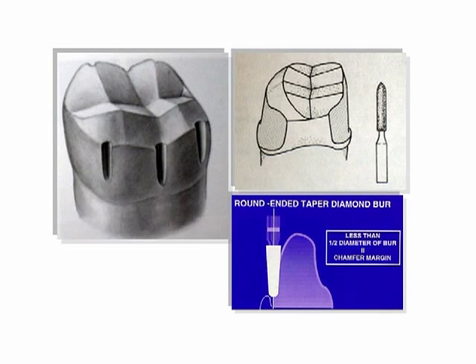The margin is 0.5 mm subgingival. Bulky over-contoured margins are a leading cause of periodontal problems. Adequate chamfer width is important to avoid an over-contoured restoration. A common error is to over-taper the axial walls.